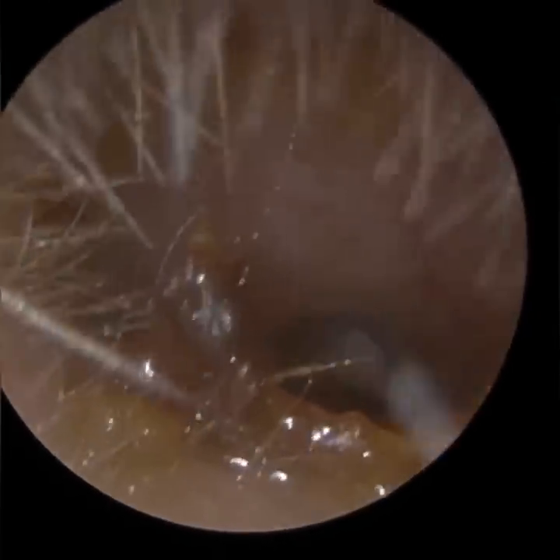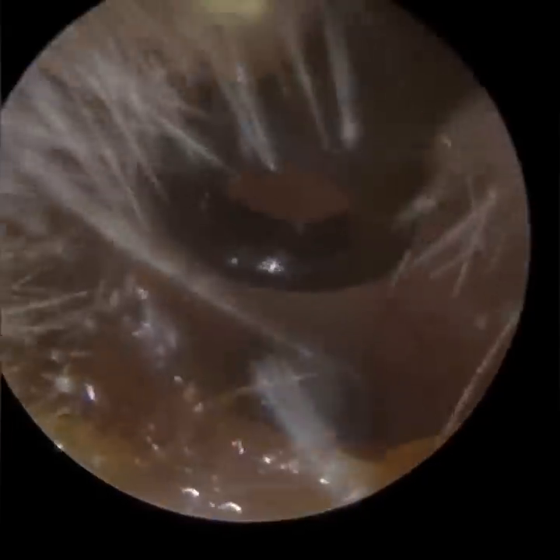Patient one – you may have noticed it would appear that they had some fungal spores within the wax. I don't know if you guys noticed that, but hopefully you did.